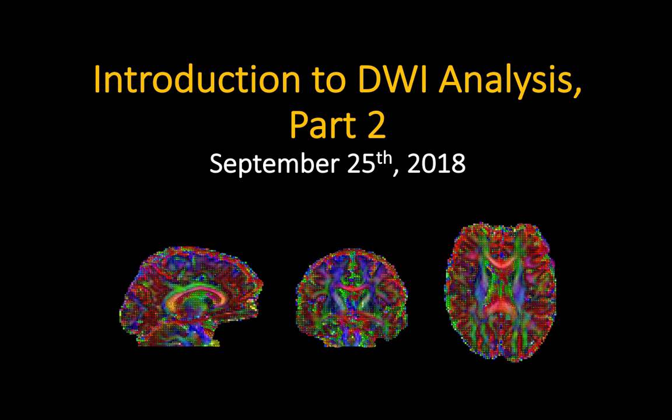I'll be talking about a different neuroimaging method. Maybe you've heard of it. We're talking about diffusion-weighted imaging analysis. But this is a hybrid of both a lecture and a practical. And I'm recording this for people who want to use some of these tools I'm going to be talking about. That's a main part of my job.